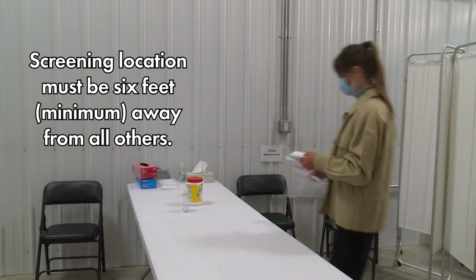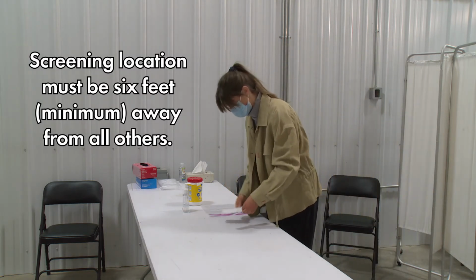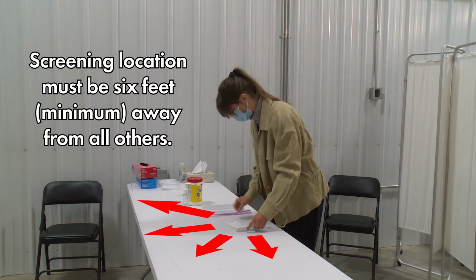And remember that that swabbing location needs to be a minimum of 6 feet away from the registration table or 6 feet away from where anybody else is standing, having specimen collections being done. Really, we need to be conscious and aware that that 6 feet minimum distance is being maintained for infection control.